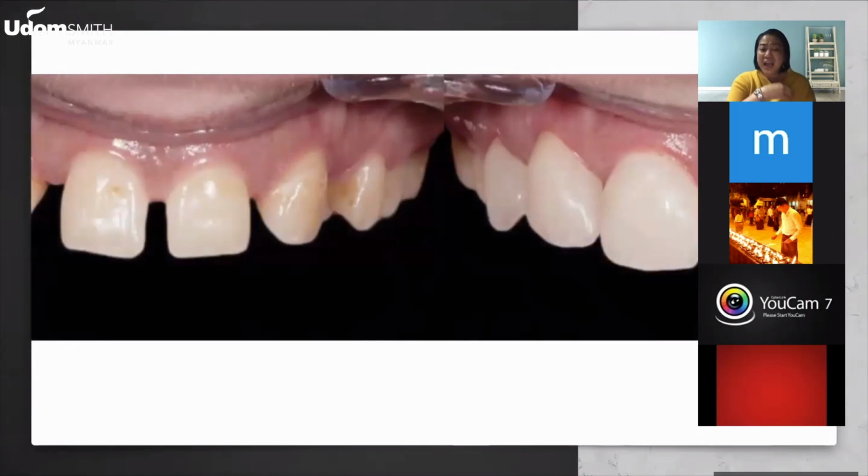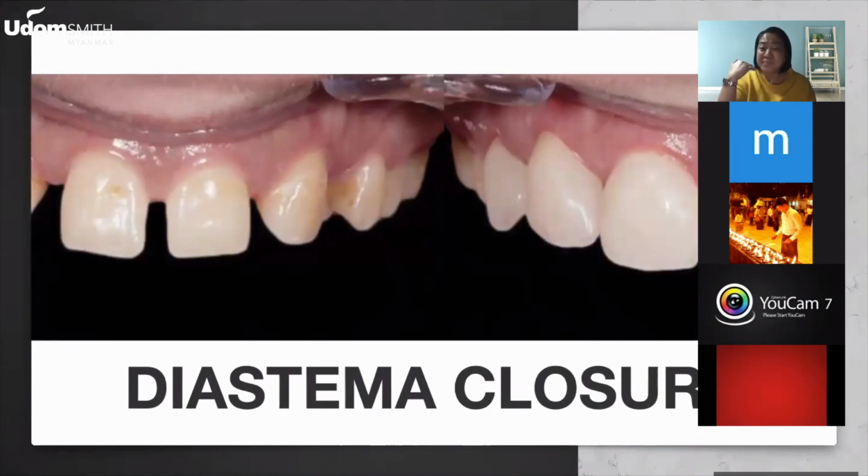Now, the next is, again, the diastema, which is similar to what is on my lower teeth. With a diastema, you do not have to create tooth preparation just so that the composite has something to hold on to when you build it directly. I have been teaching direct restoration for more than 18 years. And true, direct restoration is good. I'm not saying it's bad. But why make your life difficult when there is a material where, if you need to close a diastema, all you have to do is slightly prepare or roughen the tooth so that there is additional mechanical retention, and then just cement it. See? And then it can even last longer and it will not stain on your patient.